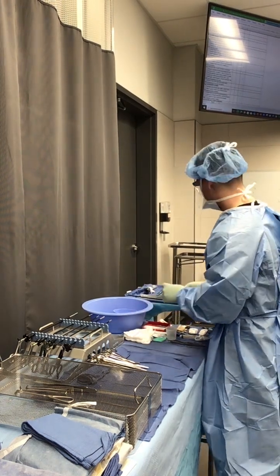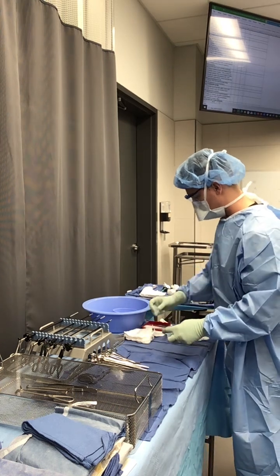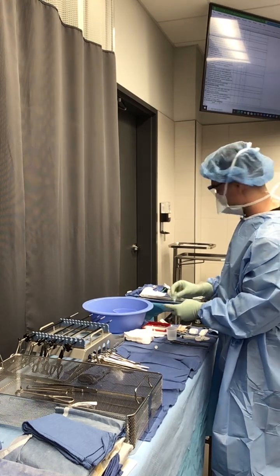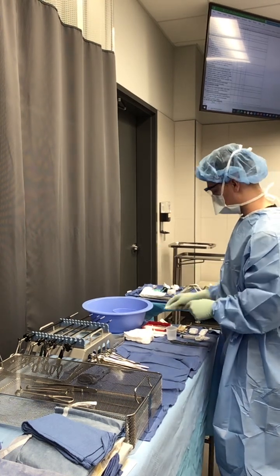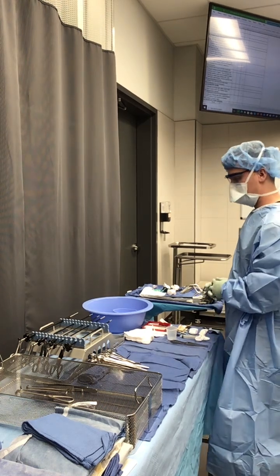Now I'm ready to place two Raytex up on my sterile field. I'll grab my Fred, take the cap off, spray a little bit on the sponge, and place that on my Mayo stand. I'll keep the bottle on my working corner so it doesn't get lost.